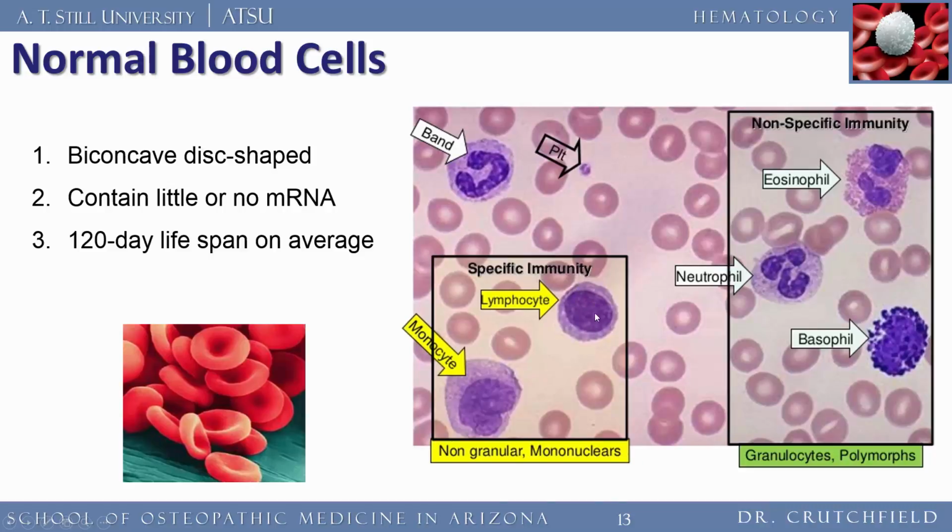Here are some of the various types of cells that we're going to learn about. So we know the red cells, these guys right here. These are normal looking red cells. They look pretty good. The reason you see that little glow in the middle is because the center of the disc is reflecting back at us. But that becomes important in someone who has anemia, who may not have enough iron, and then you're going to see that reflective surface almost completely envelop the entire red cell.